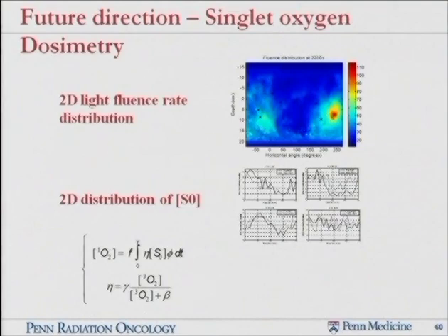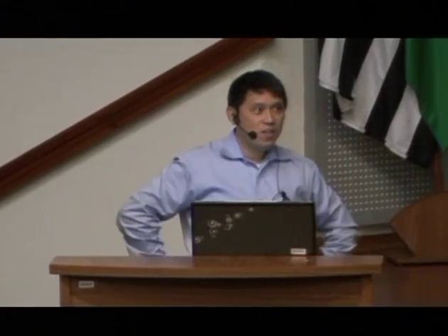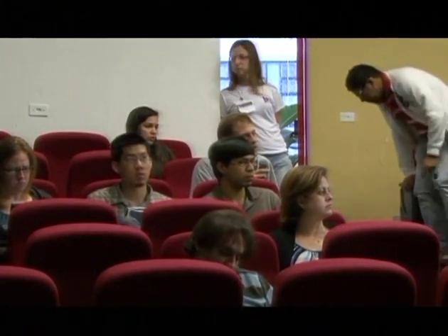Are you saying you don't like this particular method? Because we have some data where we fix the dose that we are delivering, we fix the fluence that we are delivering, and we vary the fluence rate, and we get very different results. Yeah, that is true. So if we depend on tissue optics, we're going lower and lower fluence rates.